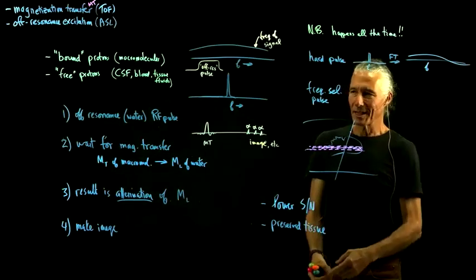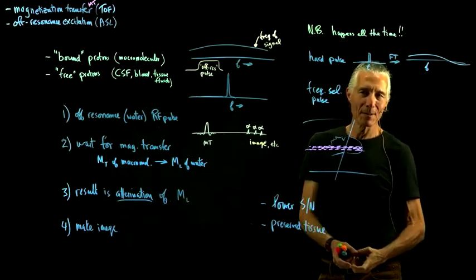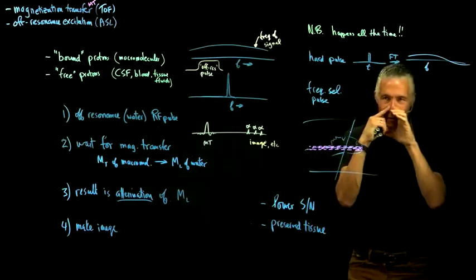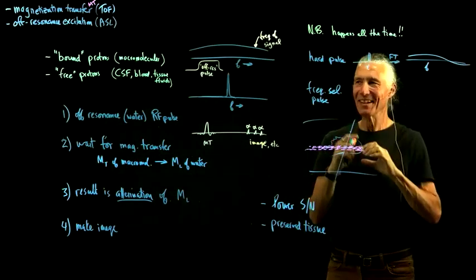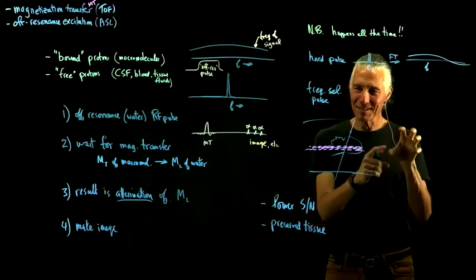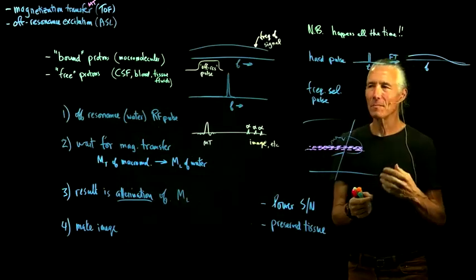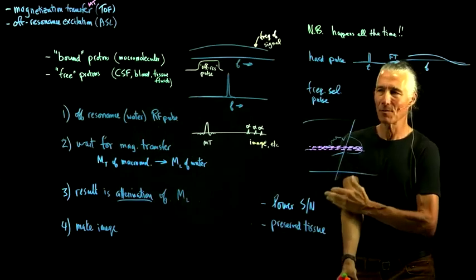What about just sticking the thing in the scanner? Yeah, the big thing about a preserved brain is it doesn't move. And so I always make the joke, like, this next scan is going to be 24 hours. Just try to stay as still as possible. Don't. And for the most part, the brain will follow those instructions, stay completely still, and so we can scan for 24 hours. And if you scan for 24 hours, you can make a higher resolution image because you've got a lot more signal to noise to work with.